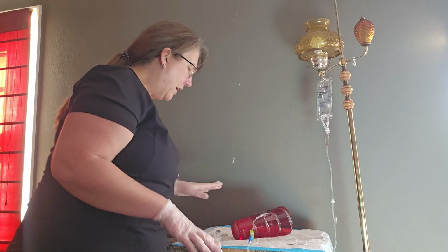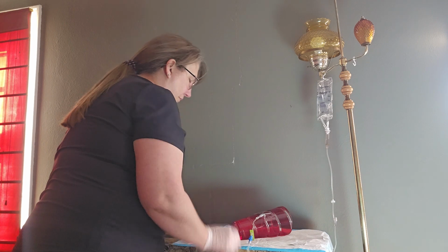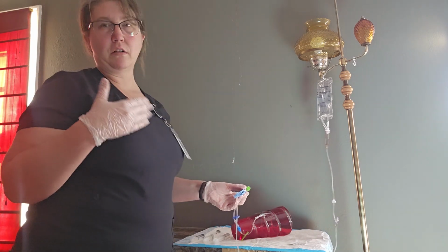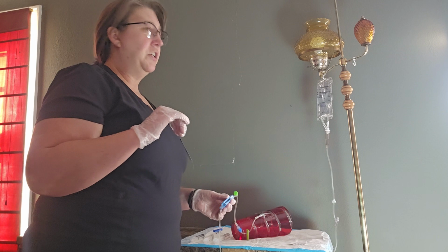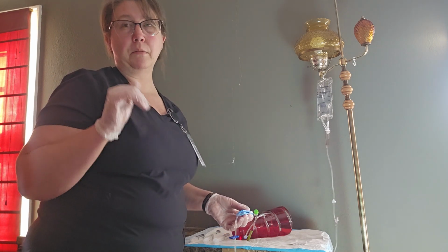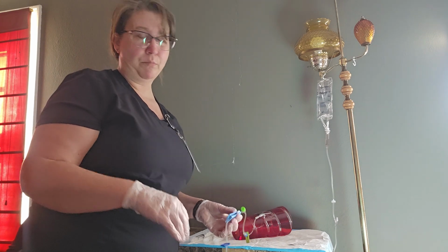Now, after we do that, like I said previously, the patient is already on an IV solution. For this video, the patient is not on an IV pump. The patient is on an IV with gravity at a gravity drip rate.